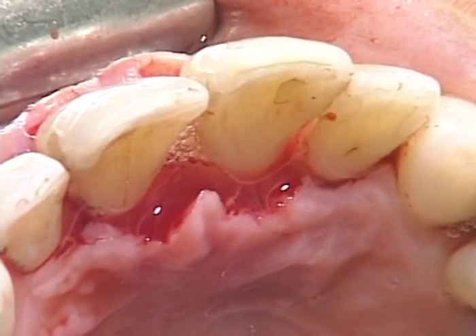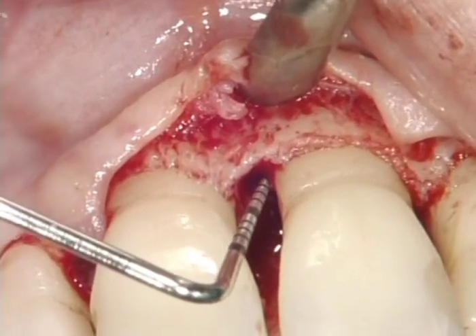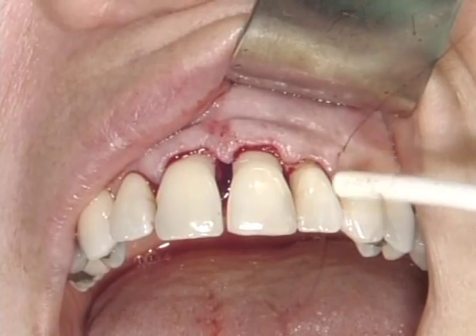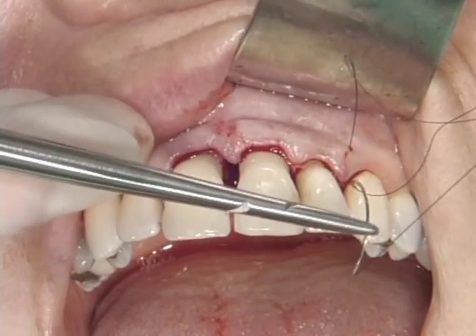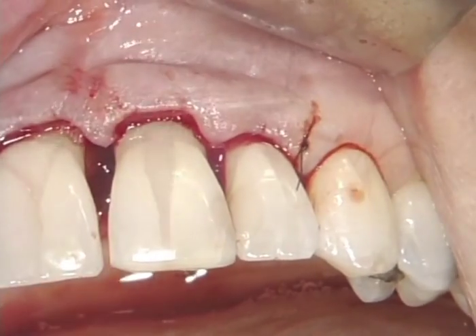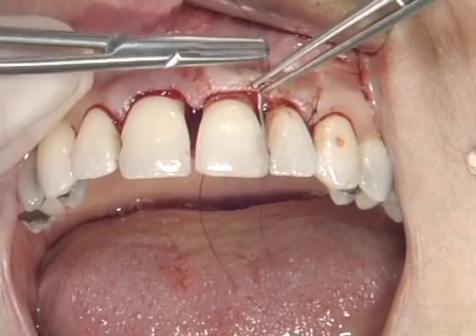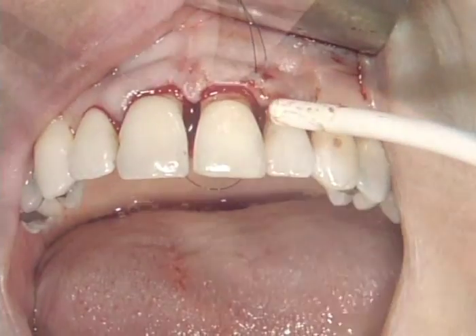Now the completely cleaned 5 mm deep defect is visible and ready for further treatment. First, the extension incision is distally sutured using a 5-0 suture material to achieve primary closure and ideal wound stability. Pre-suturing of the soft tissue around the defect will facilitate final flap closure. Therefore, the site is prepared with modified mattress sutures using a 5-0 Vicryl or Supramide suture material.